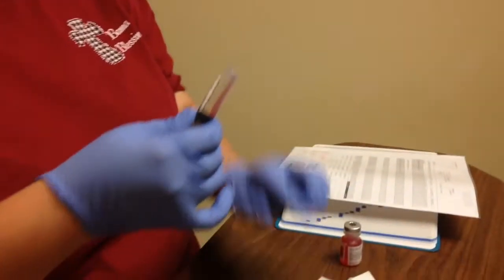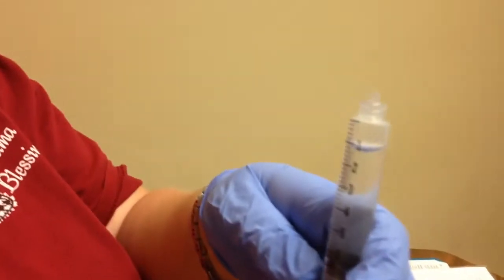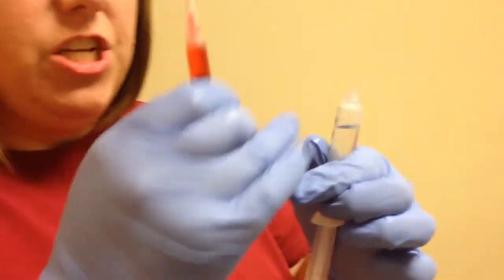So at this point, I'm going to take this cap off. I'm going to pull back just a little bit to give me some room. Alright, remember, I've already measured my medication. I've made sure it's accurate. So now I'm going to take my medication and place it into my saline, okay?